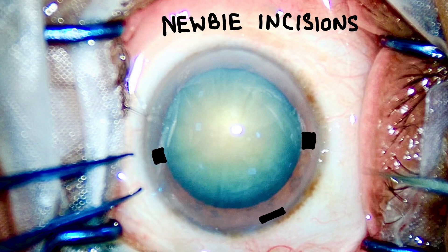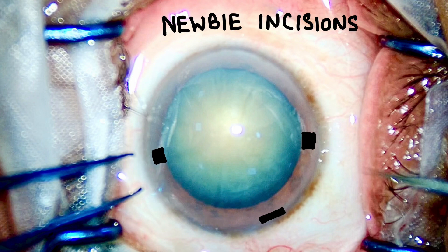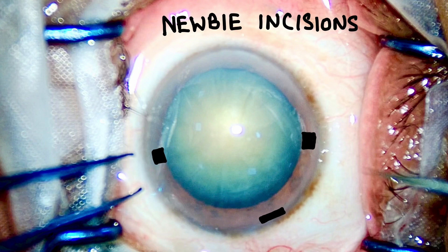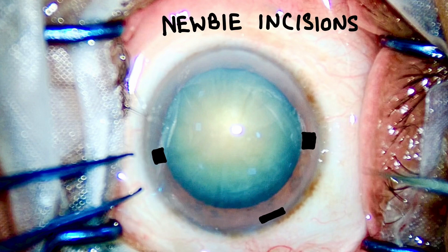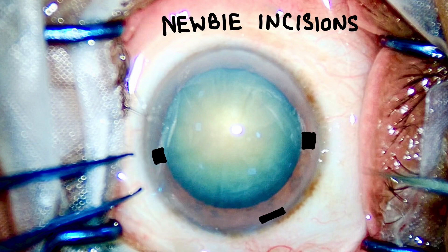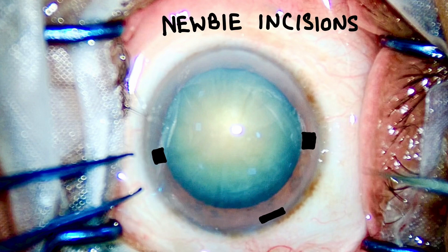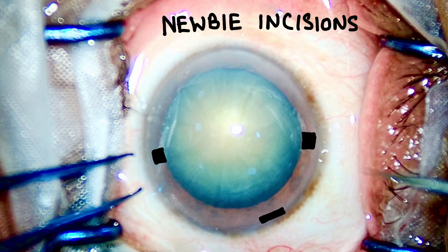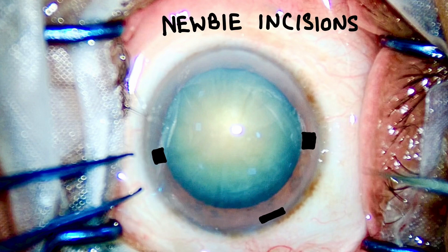As there are not a lot of resources available online for a perfect construction of side ports and main ports, I decided to touch this topic. After thousands of surgeries in the last three years after my residency, I have concluded that most new surgeons don't know how to construct a self-sealing, good clear corneal side port and a perfect main port. There is no universal technique to go with all the cases you will encounter in your professional career, but once you start to operate these volumes of cases, you will need to be a versatile surgeon first. In this video, I am going to demonstrate seven different techniques that go with almost 99% of cases.